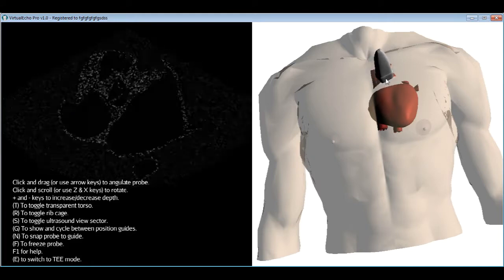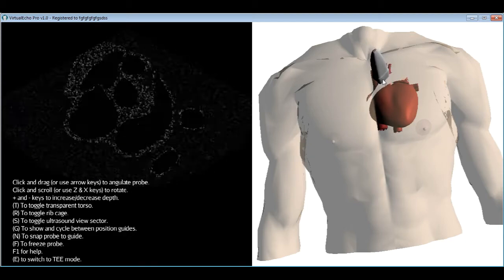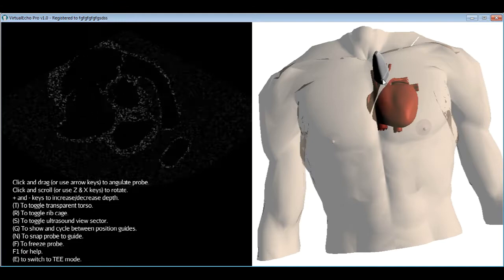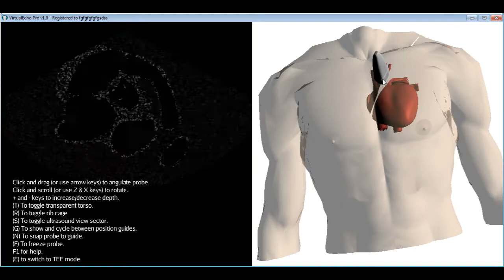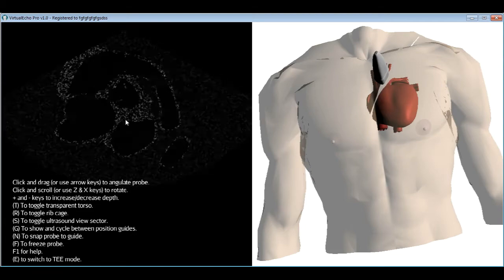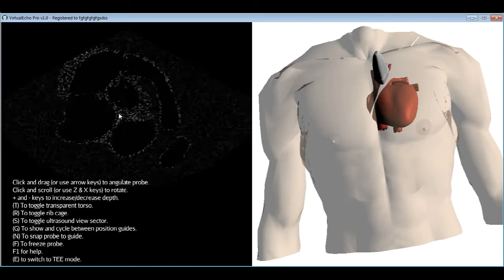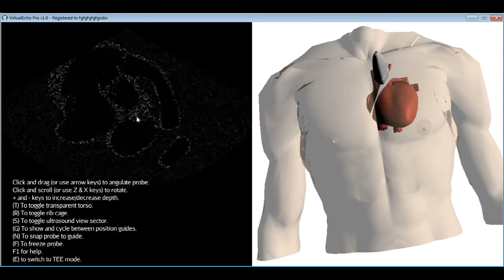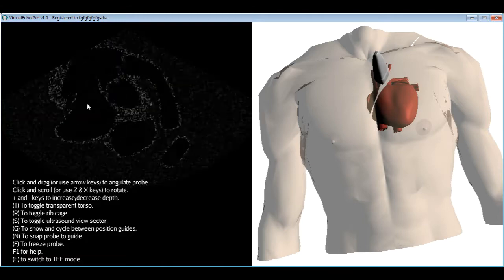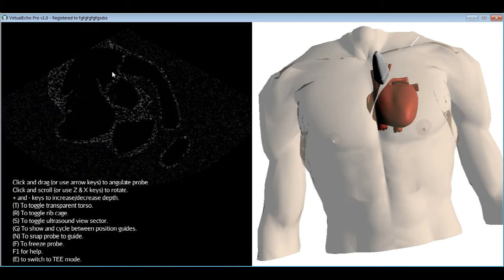This is the parasternal short axis at the basal level. The structures visible include the left atrium, right atrium, and interatrial septum — one of the good views to image the interatrial septum for the presence of an ASD. Also visible are the right ventricle, the tricuspid valve separating the right atrium from the RV, the pulmonary artery exiting the RV, and the pulmonary valve.